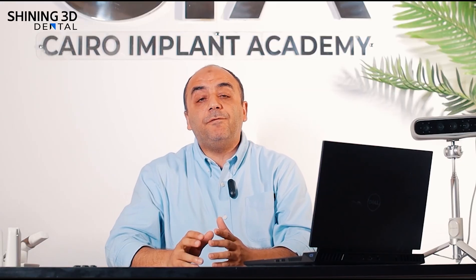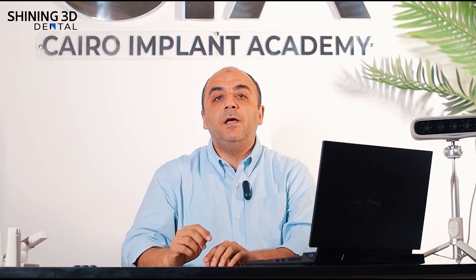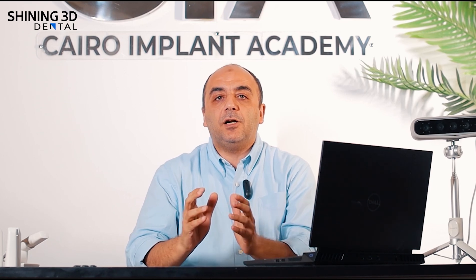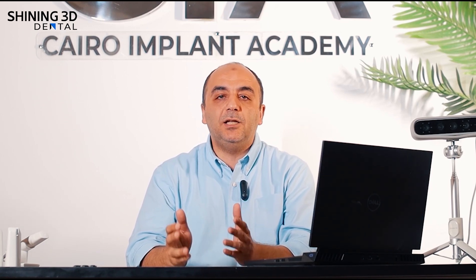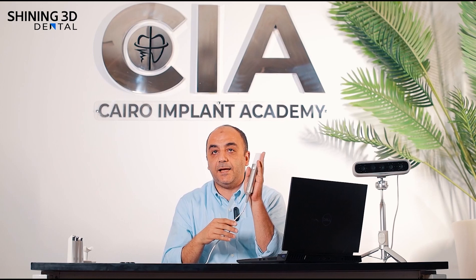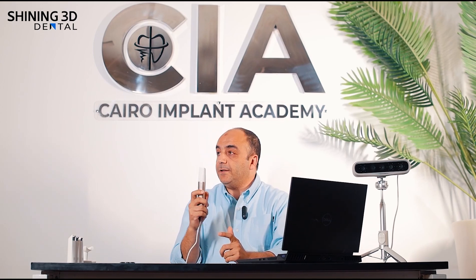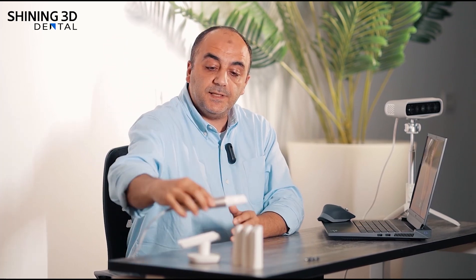The problem with photogrammetry devices available in the market is that they are very expensive, which is why they are not very familiar, especially among dentists not doing a lot of full-arch cases. This is the new scanner from Shining — it is relatively one of the smallest scanners I have ever used in my practice, actually smaller than the palm of a fist.